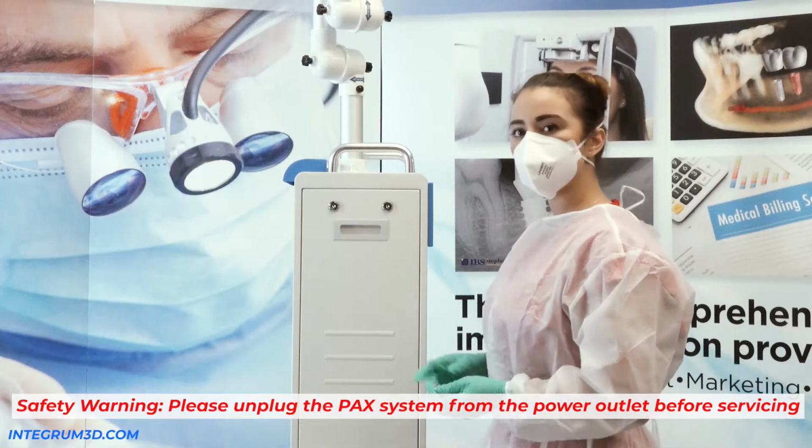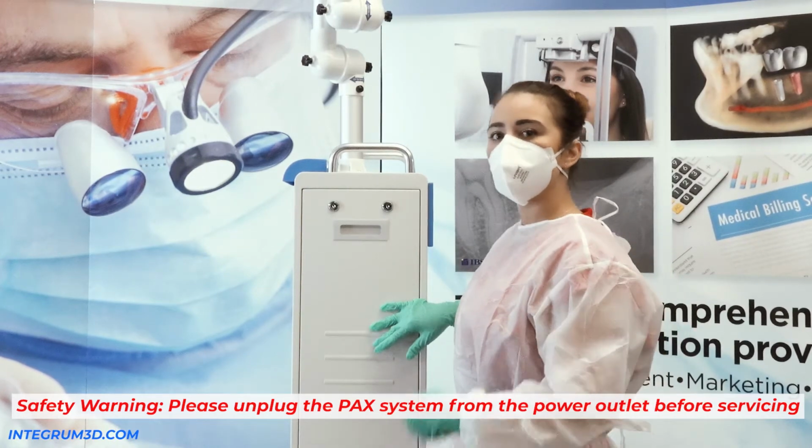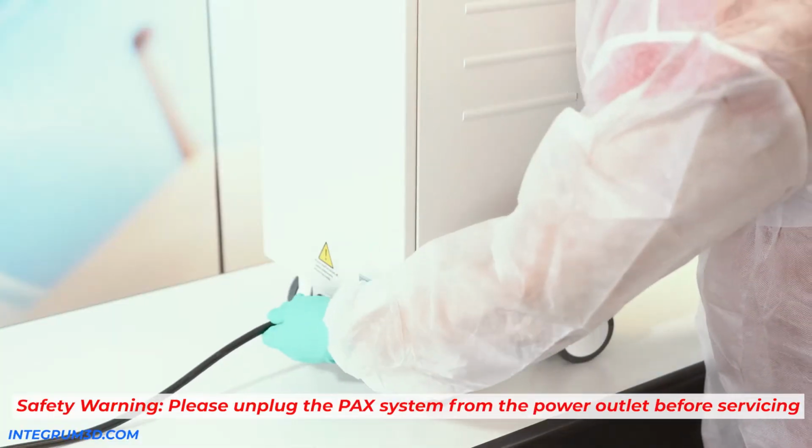When changing your filters, your UVC light bulb, or replacing the fuse, make sure that you unplug the machine before doing so.